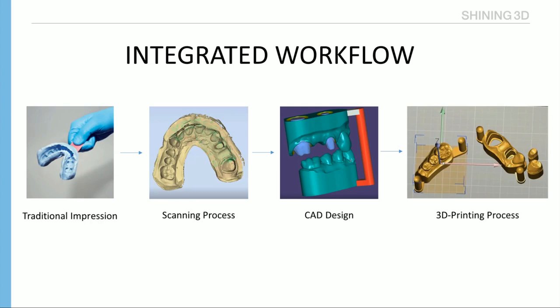Last but not least, we will have a detailed description of the technical features of our DLP printer AccuFab-D1, and we will see how to use it at its best in order to print the model that we have created in Exocad Model Creator.